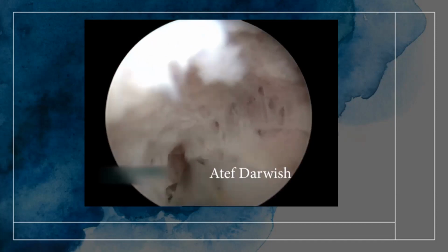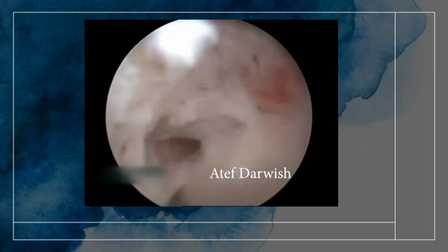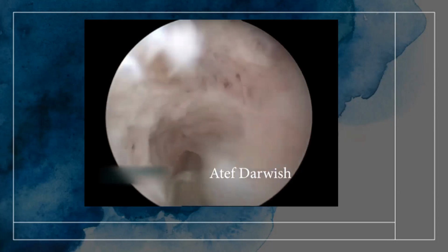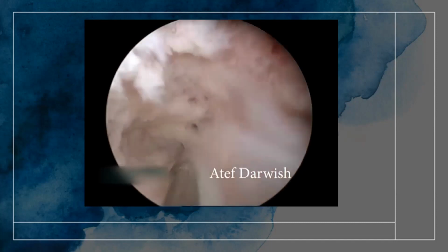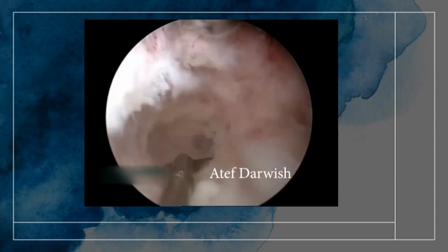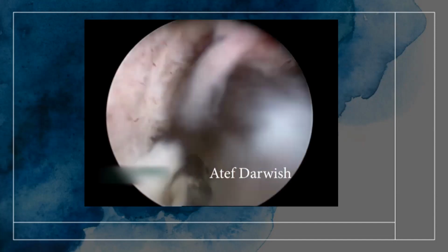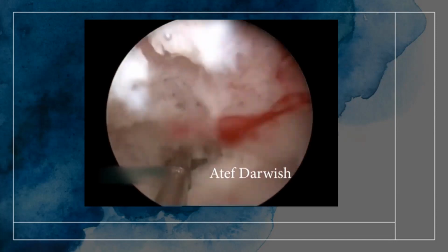You have to continue adhesiolysis to cut all fine and thick adhesions around the Darwish Hysteroscopic Triad. Now you can see the ostium, and you can go on to see the intramural part of the fallopian tube and the dark spot. Again, you continue to make adhesiolysis of some adhesions away from this Darwish Hysteroscopic Triad to make the cornual end of the tube as normal as the left side. You have to be very meticulous to avoid perforation or damage of the healthy endometrium.